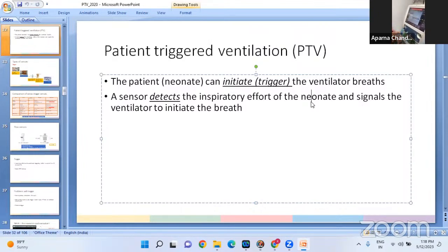Likewise, it is also important to calibrate oxygen. The SLE asks for oxygen calibration. This ensures that the oxygen cell, which senses the delivered oxygen, is also calibrated from time to time. This takes almost 4 minutes. You can start it and leave it on so that we get an accurate measurement of the FiO2 that we are delivering to the patient.